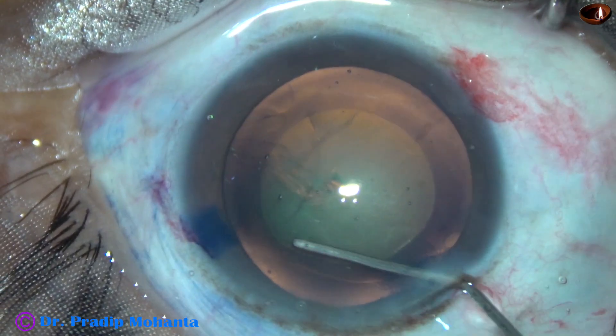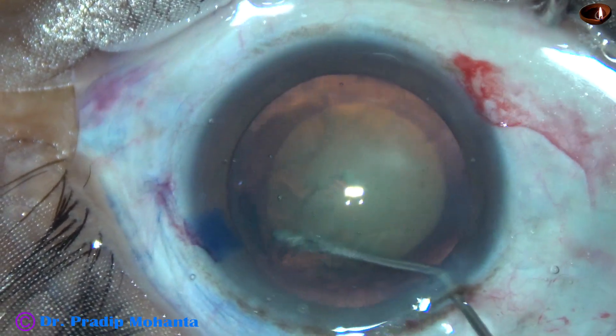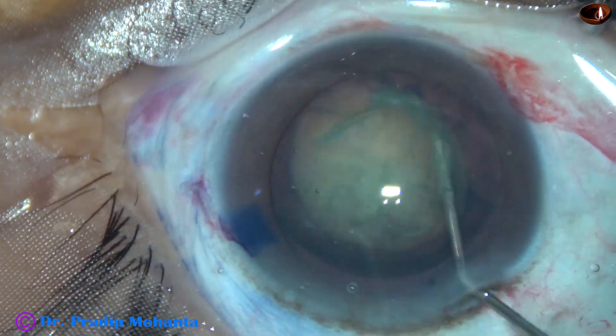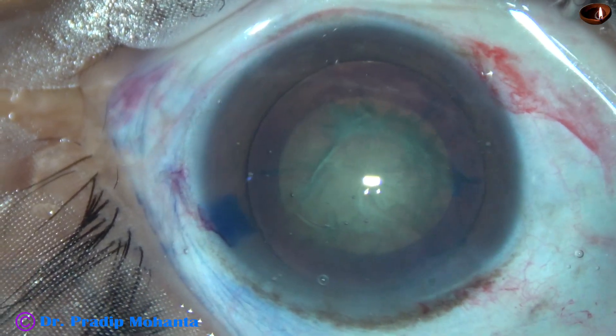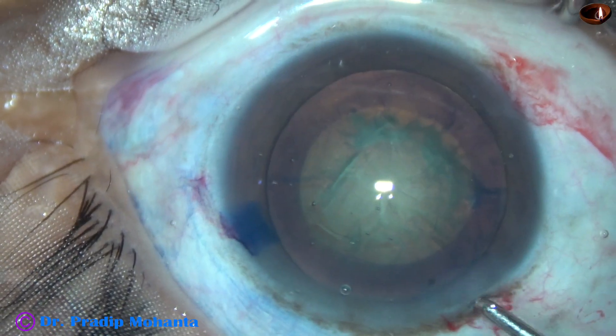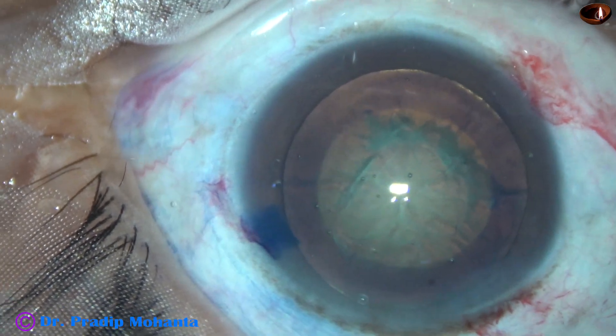And now hydrodissection and hydrodelineation. The nucleus is tapped and the nucleus is rotated. Some more viscoelastic is injected into the anterior chamber.